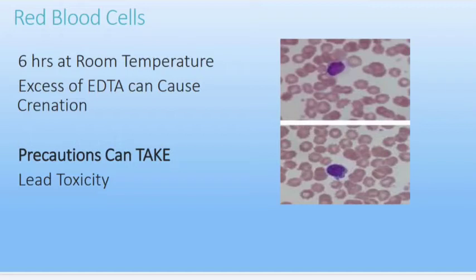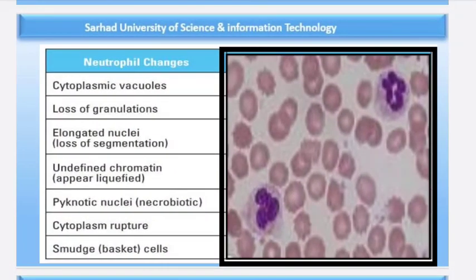In fresh blood films, platelets usually clump, making it less easy to estimate the platelet count from inspection of the film. Such films are nevertheless of particular value in investigating patients suffering from purpura. In certain rare conditions, the absence of platelet clumping is a useful pointer to the diagnosis. An expert eye can observe all these changes, but morphological or degenerative changes should prompt looking toward the white blood cell count or other secondary causes.